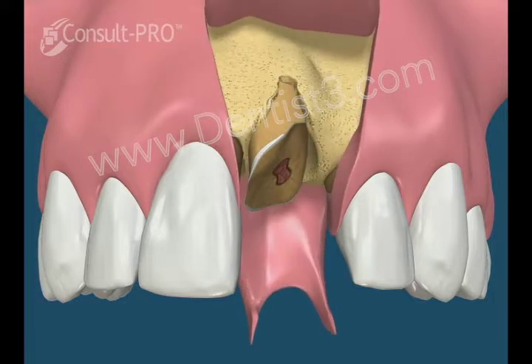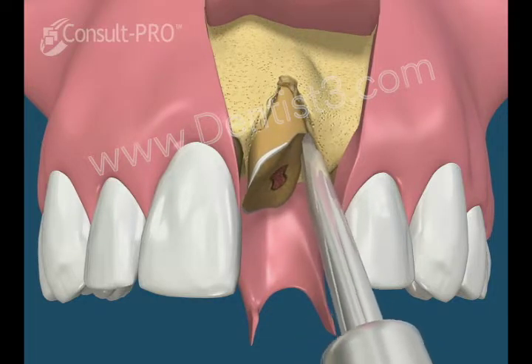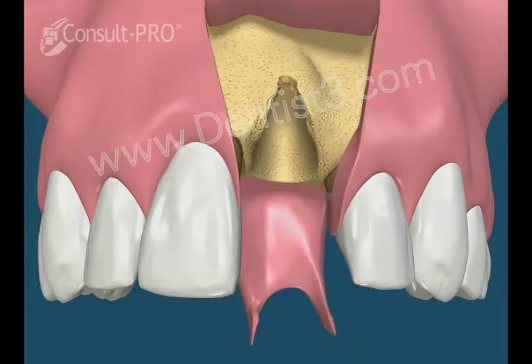The gum is reflected and the tooth is carefully removed without damaging more bone. The void created by the tooth root is now ready to be prepared.